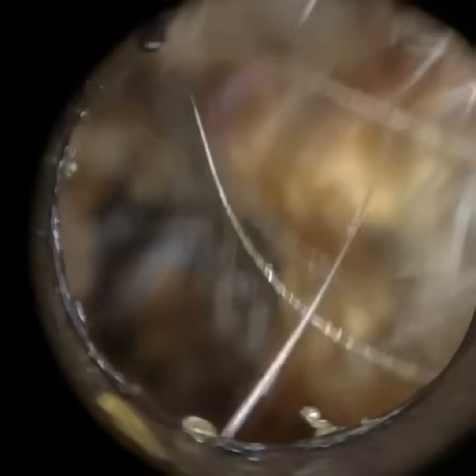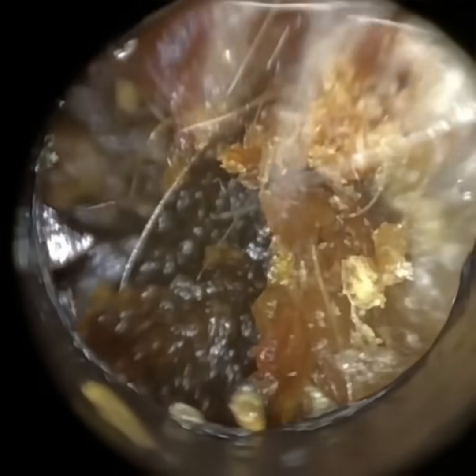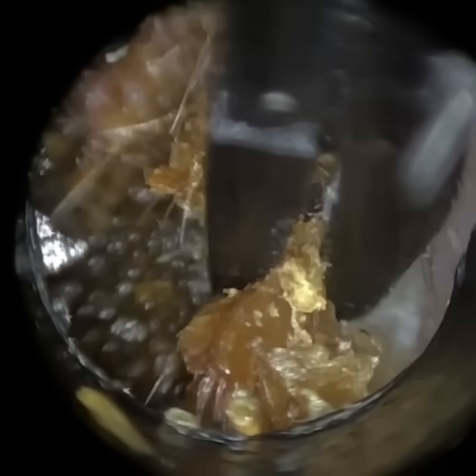It probably does take a bit of training, but I'm able to judge the depth because I'm always on the eardrum. If you watch the videos, we're quite comfortably working on the eardrum with that. So I'm obtaining depth perception with the endoscope differently. I'm using what we call monocular cues. With an endoscope, you've got such a fantastic wide field of view. You can see the entire ear canal, and from that you can look at different landmarks and decipher where you are in the ear.